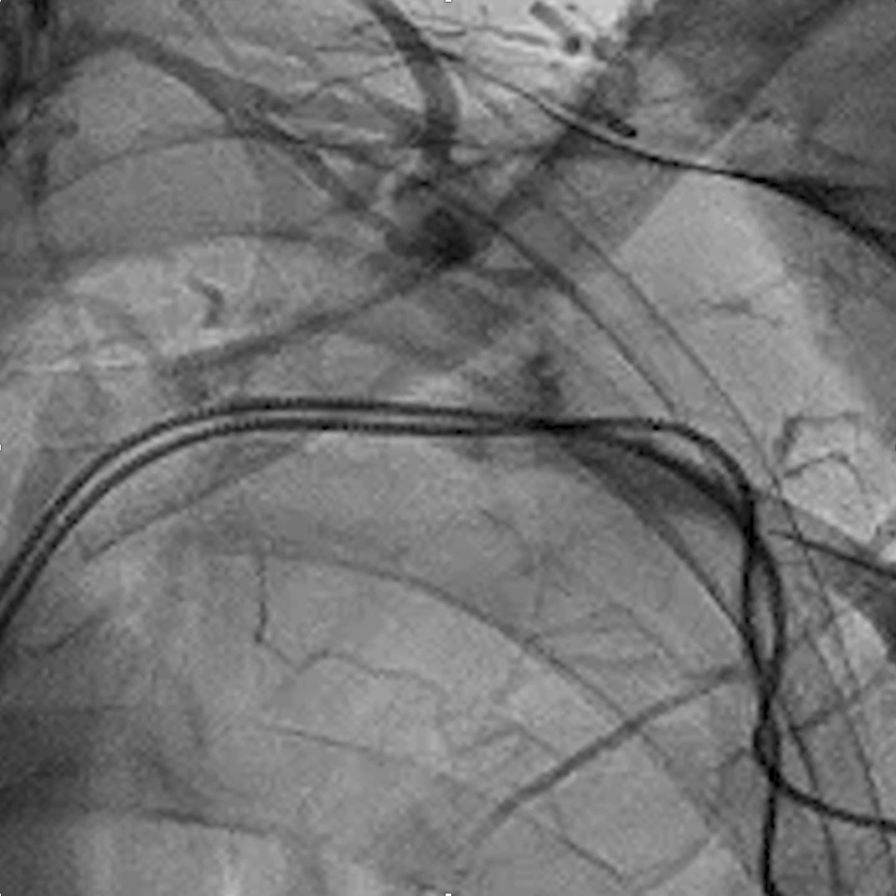We'll access while the contrast is flowing. And you can see here where the vein is indenting as the needle enters the vein.